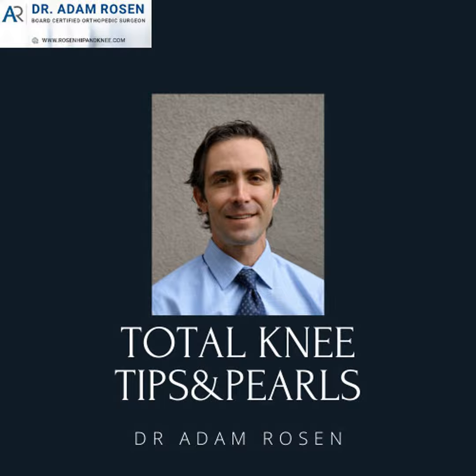People are sometimes afraid to do an osteotomy, but we know that if it protects you from damaging the femur while trying to take out a well-fixed stem, it is a safer alternative. So although we may not want to do a quad snip or turn down, you may do that to prevent an avulsion off the tibial tubercle. The last option of resort, in my opinion, is doing a tubercle osteotomy and letting the bone hinge open, so you can repair the bone back to the bone at the end of the case.